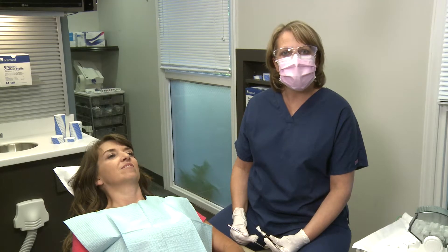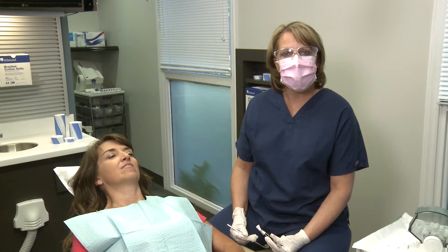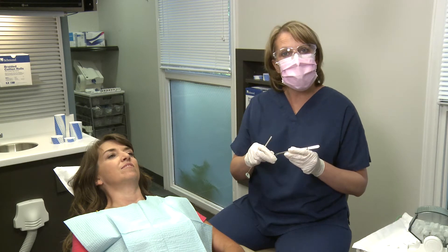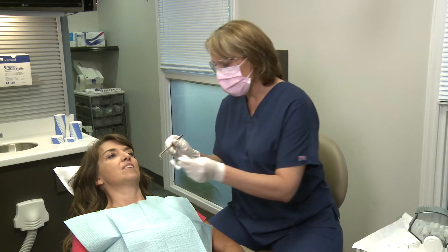Richmond's braided cotton rolls are known for their high quality. Their superior absorption can be attributed to their unique wicking ability. They are held together with a silky yarn rather than starch, so they do not stick to the mucosa or require re-wetting before removal.